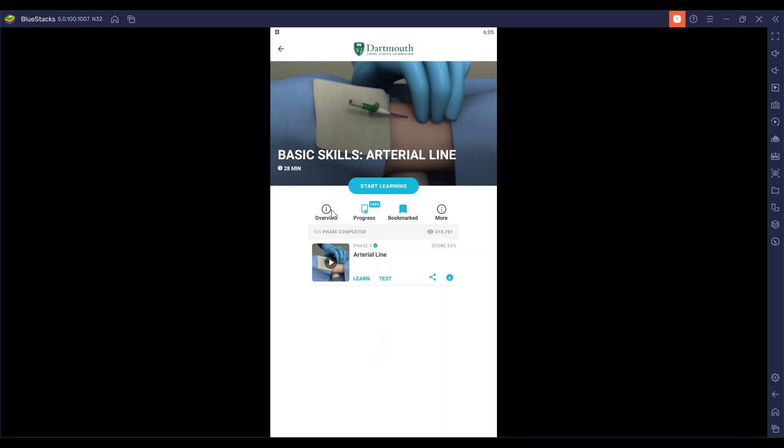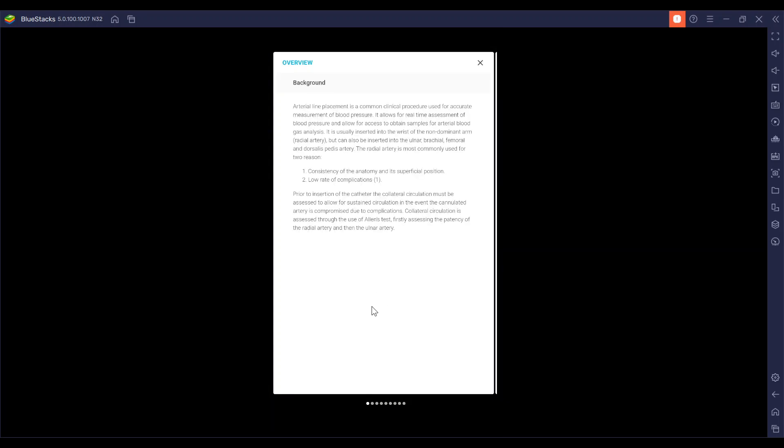So basic overview. An arterial line placement is a common clinical procedure used for accurate measurement of blood pressure. It allows for real-time assessment of blood pressure and allows for access to obtain samples for arterial blood gas analysis.